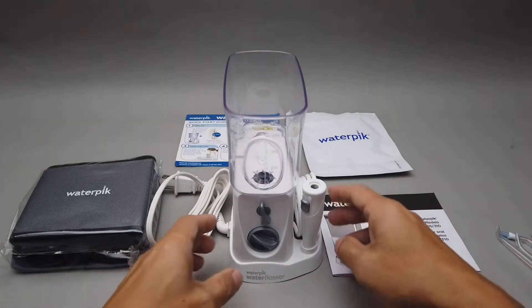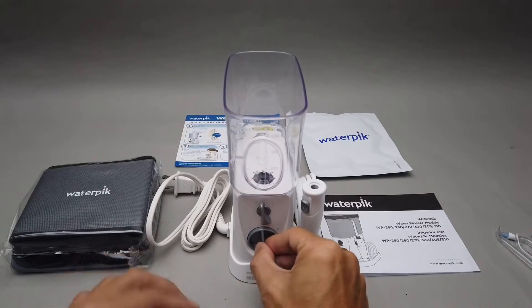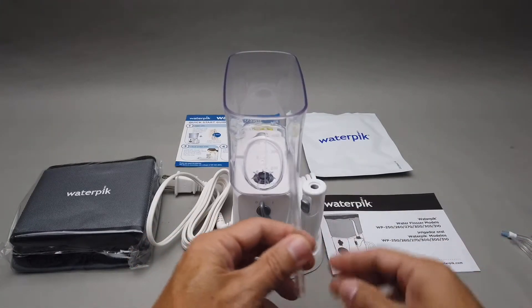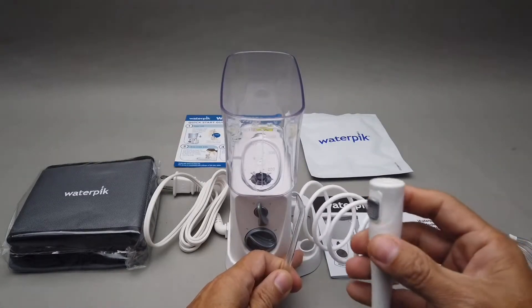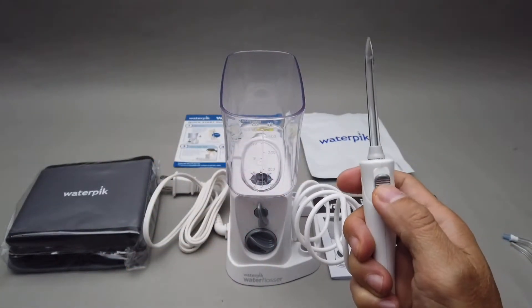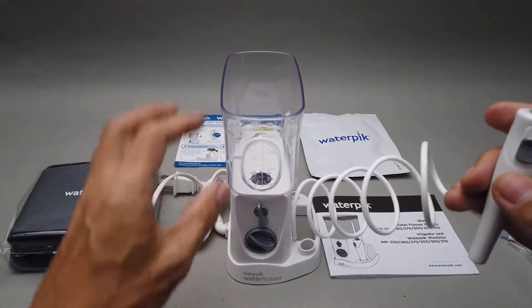This is the power switch — on and off. This is the pressure dial: the higher the number, the higher the pressure. Then you pick one of these nozzles, take out the handle, stick it in there, and you hear a click. This button is just to unlock and lock the nozzle — it's not a regular switch.